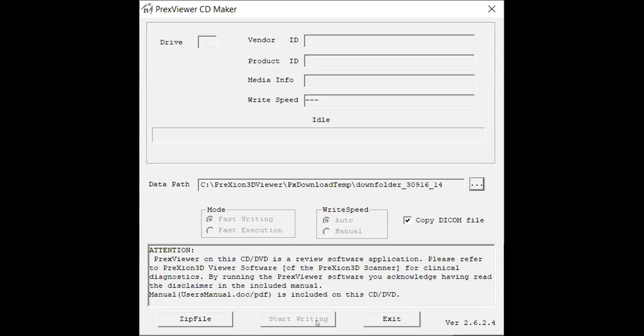Once you do that you'll see a progress bar which will show the copying of those files. Once finished you will get a last pop-up which will show completed files and your disk will actually automatically eject from the drive and this is how you'll know those files have been completely copied over onto the disk.